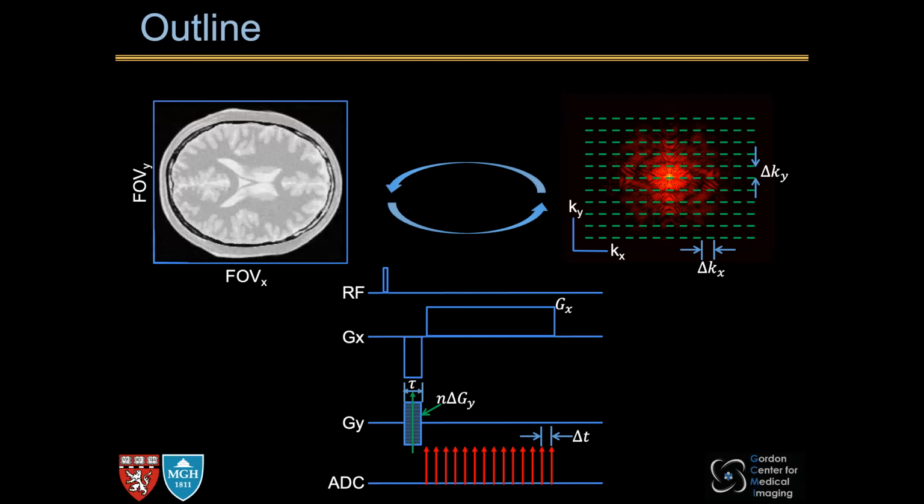Okay, so in the first lecture, Dr. Wu introduced the basic principles of NMR, especially where the NMR signals come from and what the properties of the signals are. So in this lecture, we'll discuss how to utilize the NMR physics for imaging. We'll discuss how to design all these different magnetic fields, like the radio frequency fields and the gradient fields, to encode spatial information in the received signal, how to decode this information for image reconstruction, and how to characterize the properties of the reconstructed images.